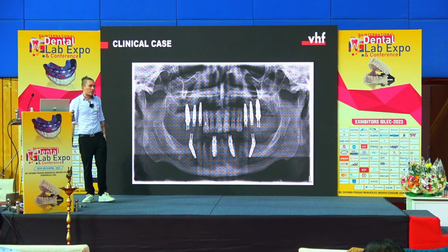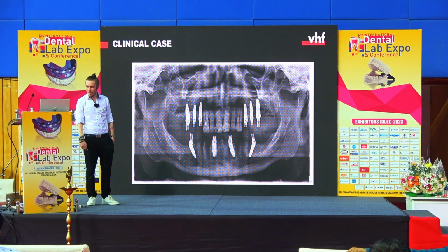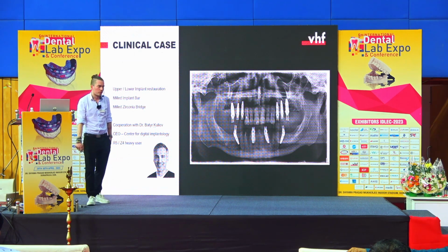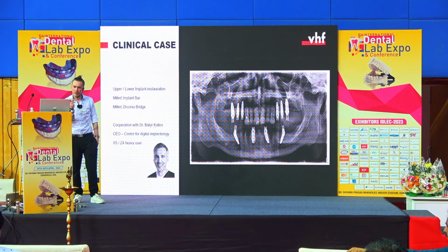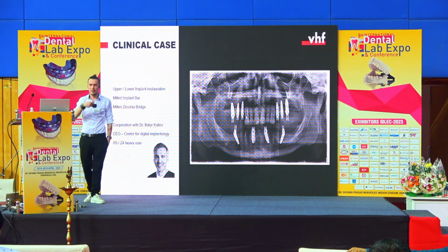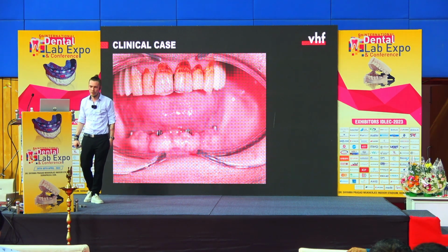But the best proof of concept is always the practical. So we have also some clinical cases that we did. We have been working together with a doctor, he's also living in the southern part of Germany. And what we did is we made some upper and lower restorations with a milled implant bar and then a bridge later on it that I just want to introduce to you.